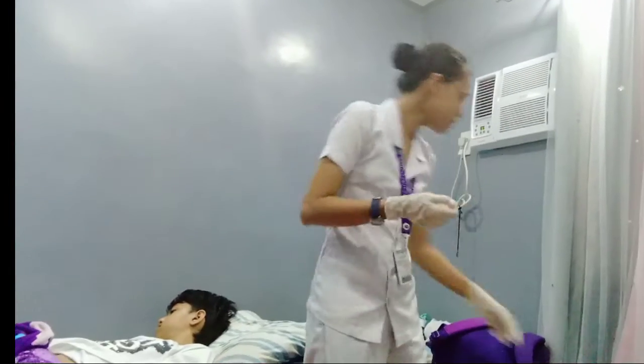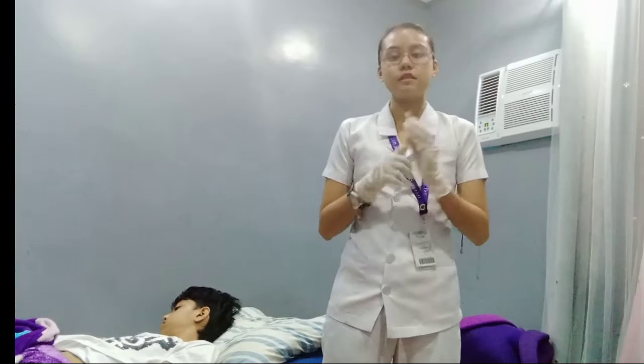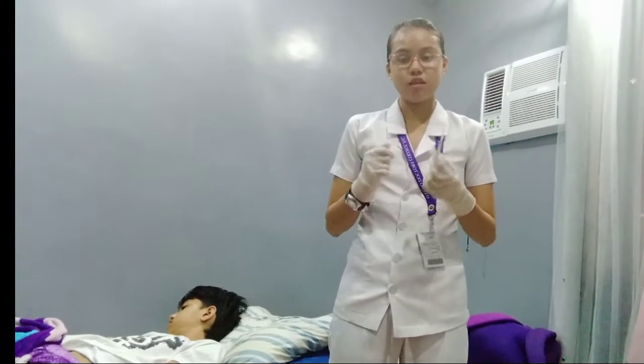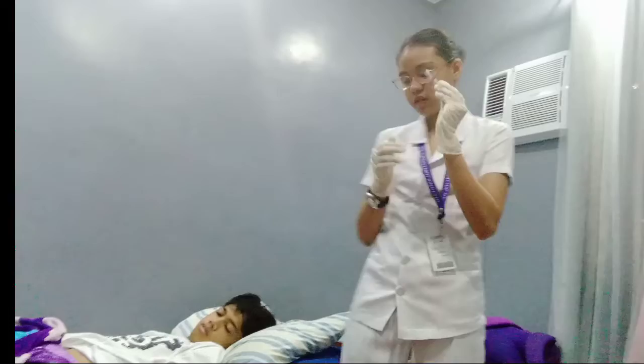Afterwards, we need to insert the needle firmly at a 45 to 90 degree angle and release the pinched skin. Rest your non-dominant hand on the patient to create a skin fold and again pull away fat from the muscle and to prevent feeling pain. Okay? Hold the syringe like you're holding a dart, just like this.